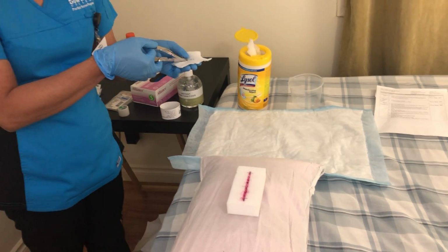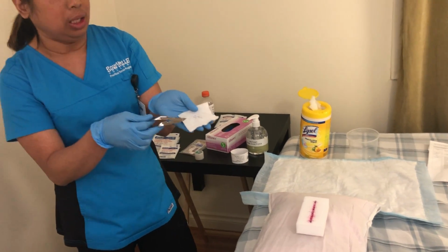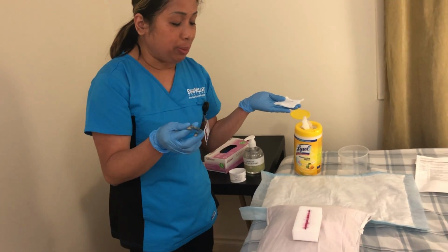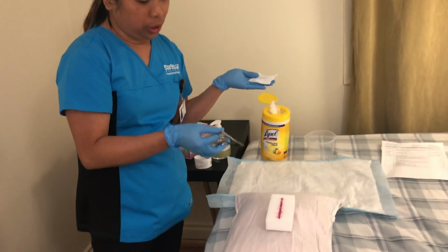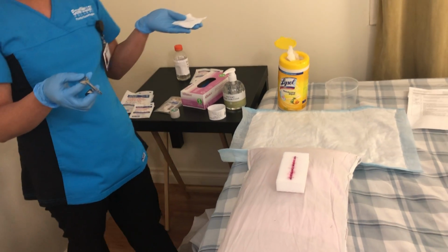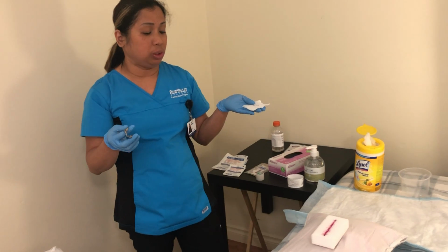Since I removed two staples, I will count them. It's 1 and 2. Then I will also count the staples that remain: 1, 2, 3. Now I will tell the patient that the remaining staples will be removed tomorrow.